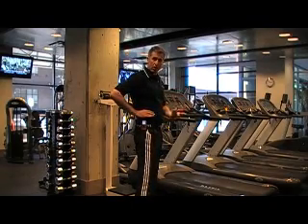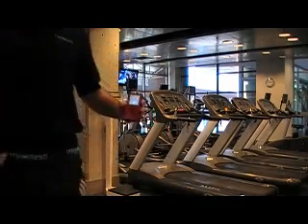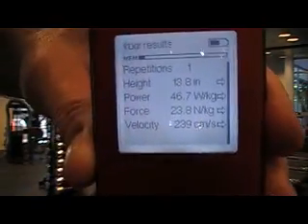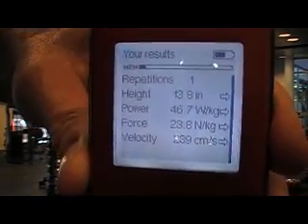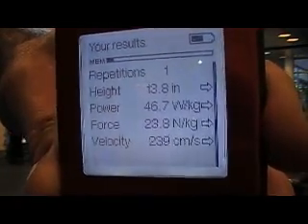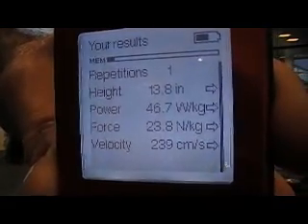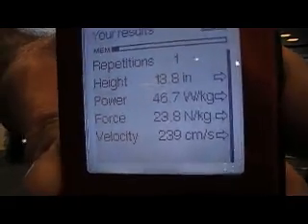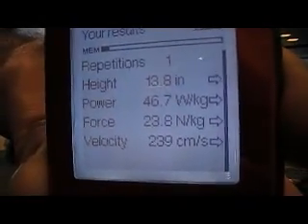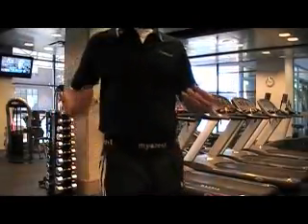The double beep means that the protocol was followed properly. Now I have some instant results. What's displayed here: my height of jump is 13.8 inches — that's vertical hip displacement, not jump and reach. Power is 46.7 watts per kilo of body weight. Force is 23.8 newtons per kilo of body weight. And velocity is 239 centimeters per second. Those are my base values for a vertical jump.